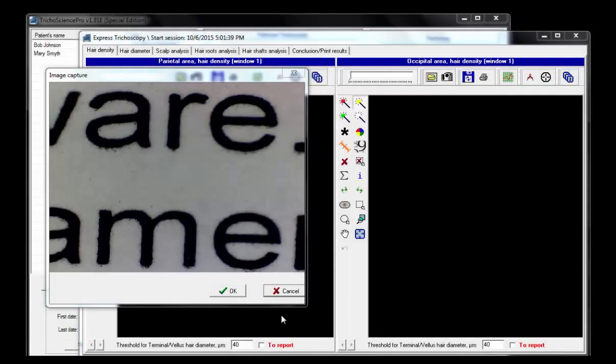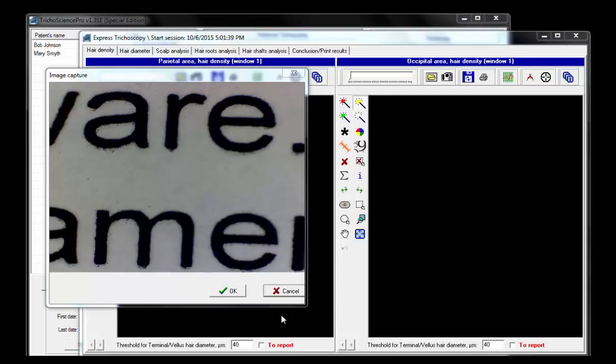Each size scope spacer can achieve 1 or 2 levels of magnification. I would recommend using the mid-size scope spacer for most applications. With the mid-size scope spacer attached to the front of my Tricoscope, I'm now going to be showing you on the screen what it looks like when I use the focus roller to focus at those 2 levels of magnification.